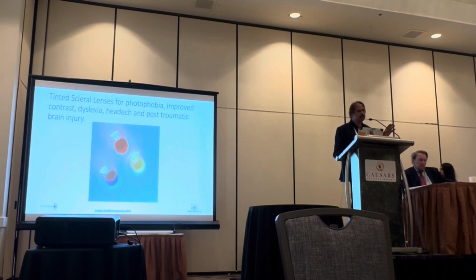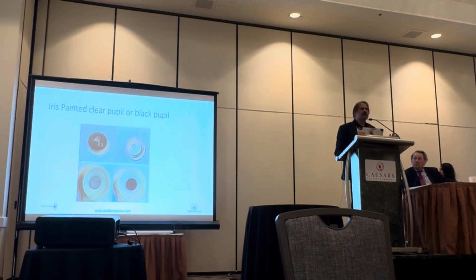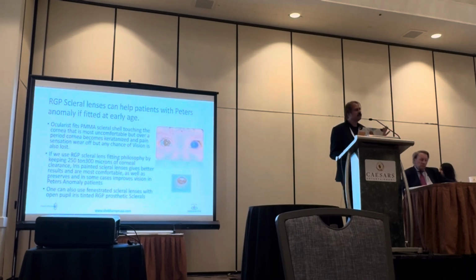But if you can incorporate red, blue, green, whatever tint, it can be used as a therapeutic for dyslexia, headache, post-traumatic injuries, improves contrast, helps with photophobia, helps with color blindness. So it depends on how you want to use this technique. As this picture shows, there is an opaque layer from the back that stops the light, and if you need a tint, then of course it is a semi-transparent lens.